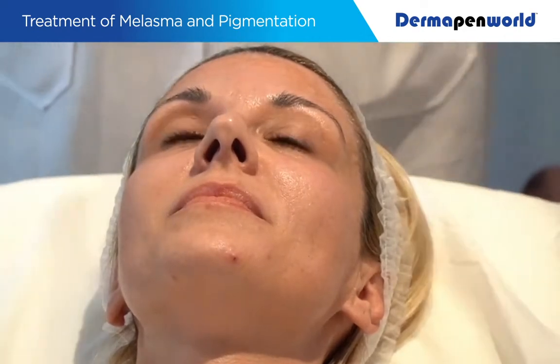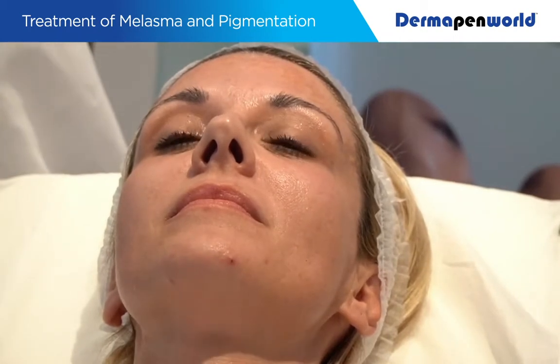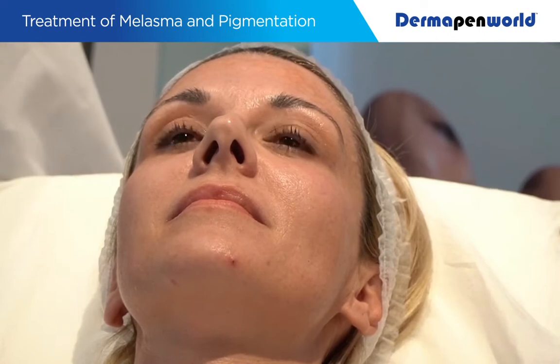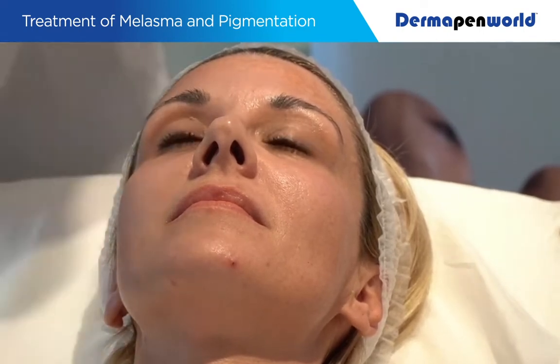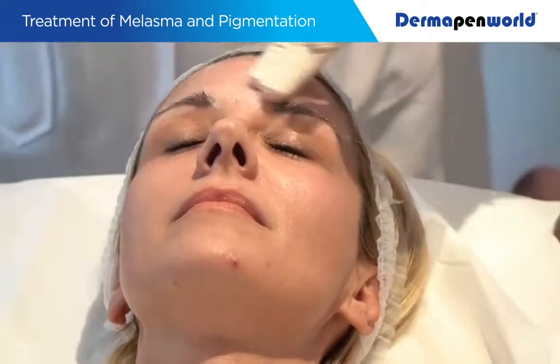Otherwise, I keep talking. So at this point, my left hand is going to distribute, just using my fingers, the Hyalactive plus the bright light. So I have a nice homogeneous gel. Apply onto the forehead like so. This becomes my procedural glide.